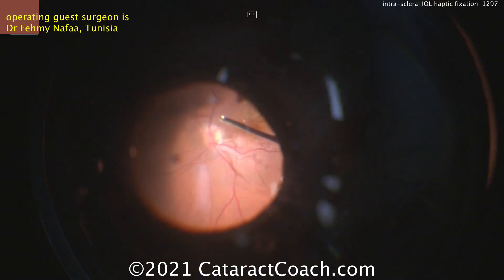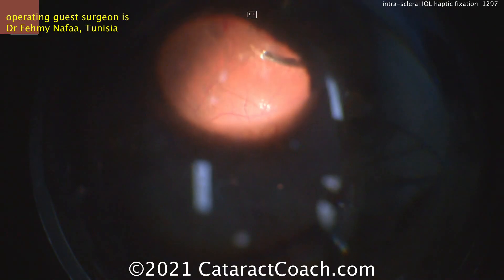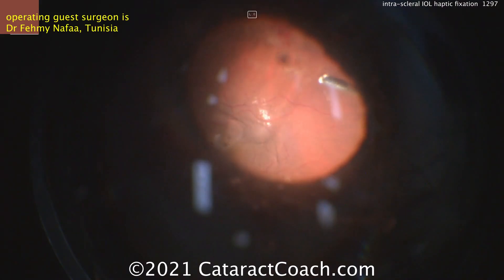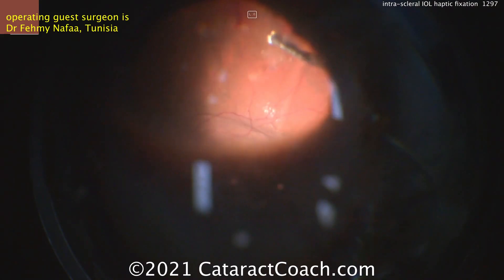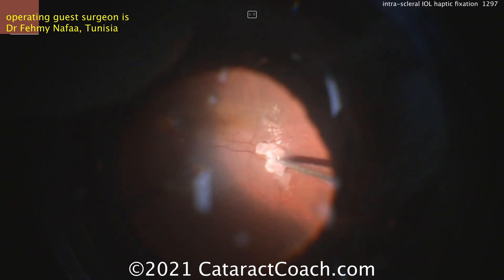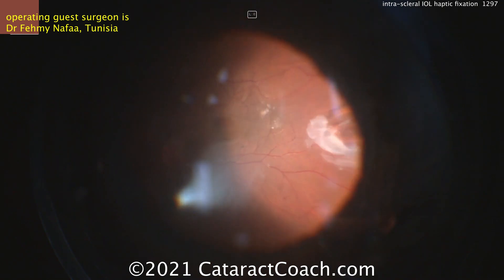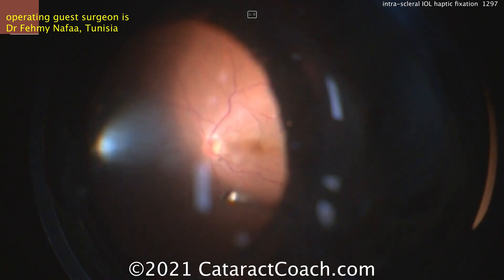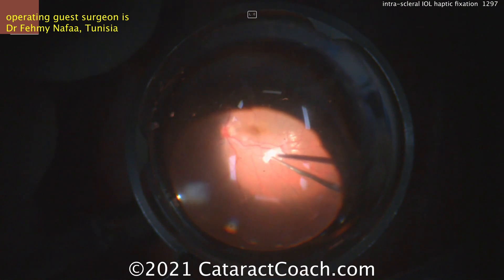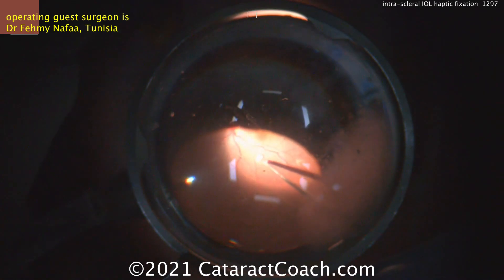This technique involves creating an intrascleral pocket, basically a tunnel, to put the haptics in. This was described by Gabor Shariath from Austria. I've also tried this combined with Dr. Amr Agarwal's glued IOL technique. The glued IOL technique is fantastic — it still creates these Shariath tunnels but uses glue to help seal down the scleral flaps that you make, which also helps bind that haptic into position.